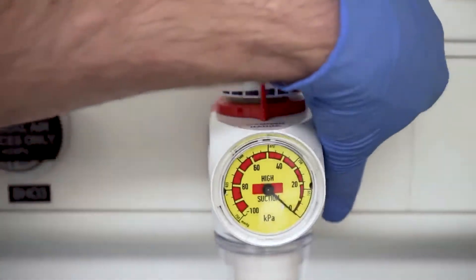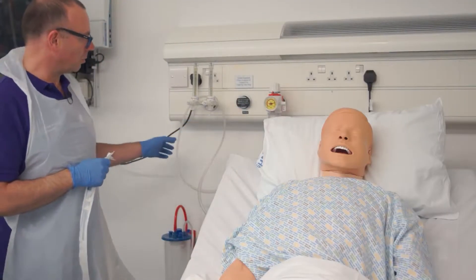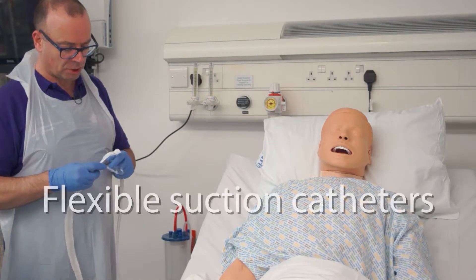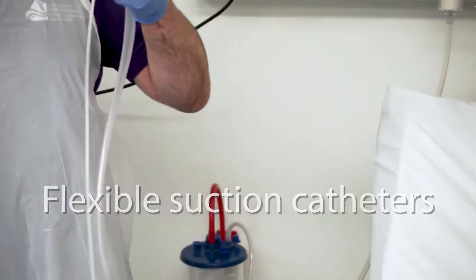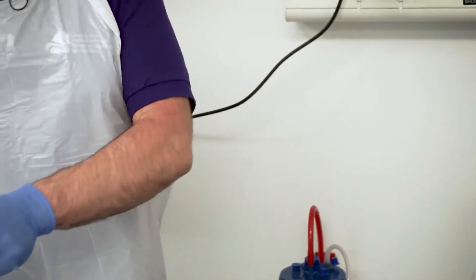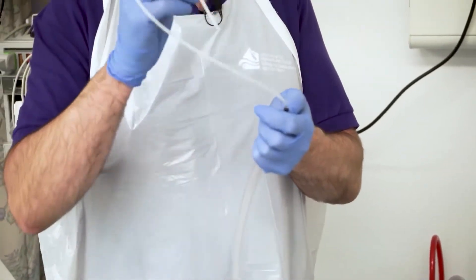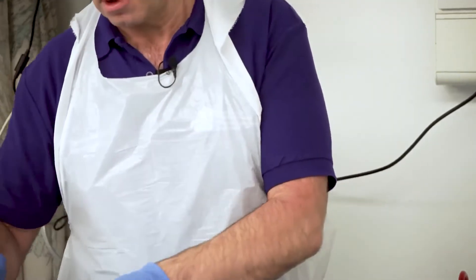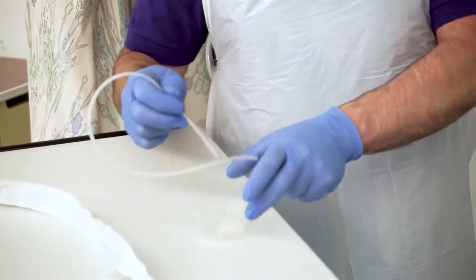We can switch this on now and we're aiming to keep a suction pressure between 100 and 150 millimetres of mercury. We've got a range of flexible suction catheters ranging from about a size 6 up to a size 18 French gauge. These have the benefit of being flexible and allow us to pass into a patient's mouth even if the teeth are closed. We can use some water-soluble lubricant if necessary.